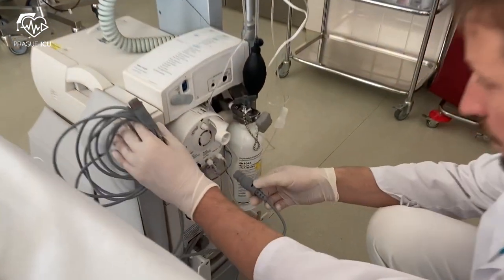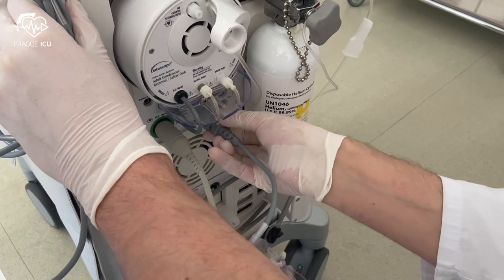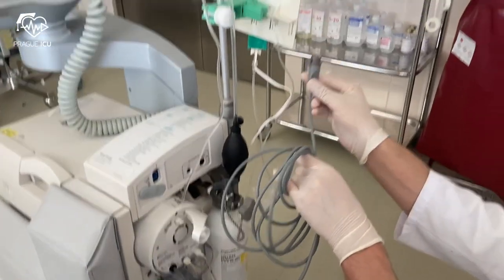In rare cases, we use the conventional pressure triggering. Here comes the pressure cable outlet. The other side is attached to the pressure transducer.